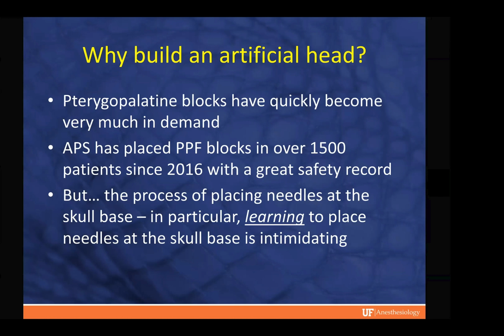And we haven't really had any safety problems with them. Probably the most serious thing that we've had is a little bit of skin bleeding where the needle goes in. And there's nothing surprising about that. When you poke somebody with a needle, it's sort of expected that there's likely to be a little bit of blood where you put the needle. But we have not encountered any serious issues with these.